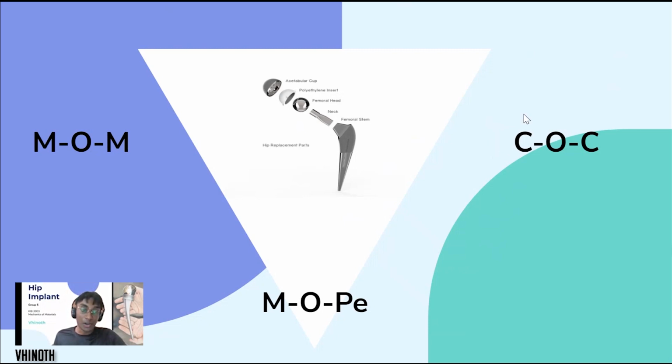This is why some surgeons opt to use metal-on-metal hip implants, or metal-on-metal hip acetabular head, which is understood from its name. It consists of a metal ball component with a metal socket, though in the past there had been some issues revolving around metallosis. Next, let's look at the ceramic on ceramic for ball and socket articulation.